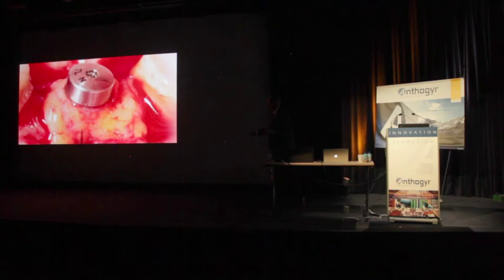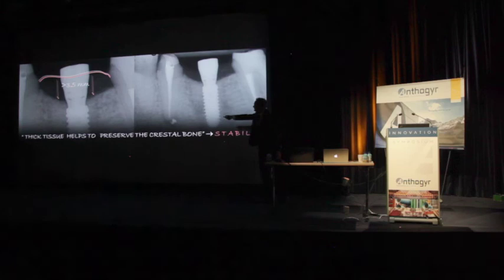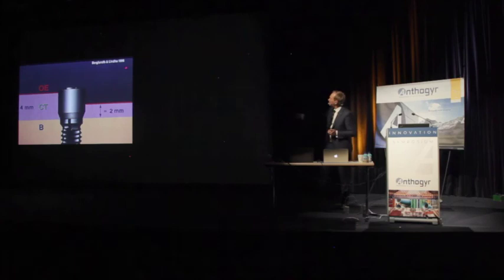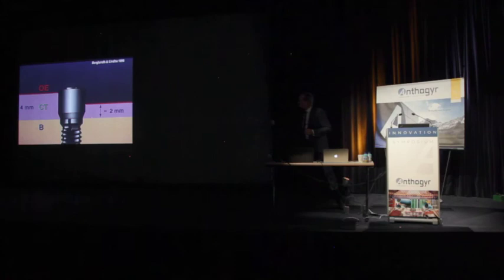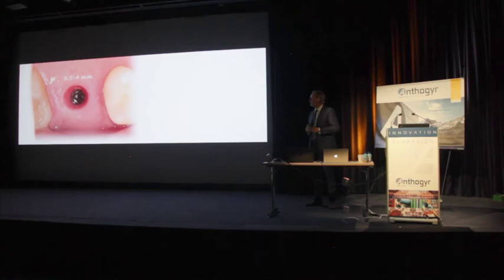And this is how it looks on the X-ray. But please remember, if you have 3.5 or more, the bone will stay where it is. So this is for me a guarantee to keep the bone in place. And this is nothing new. We know the studies from Lindhe and Berglundh, '96. They already said, if you have thin tissue, you'll get more bone resorption over here. So nothing new under the sun. It's an old story. We now have new applications with the Axiom implant concept.